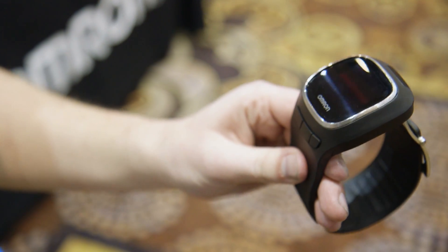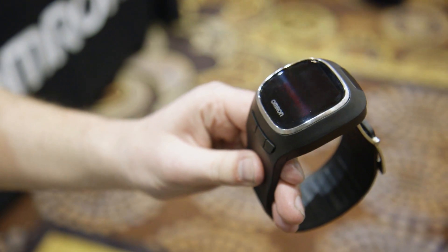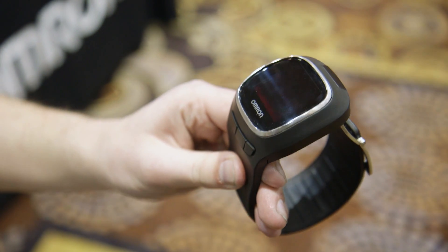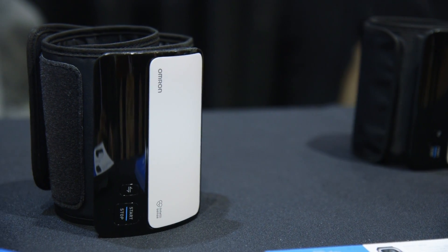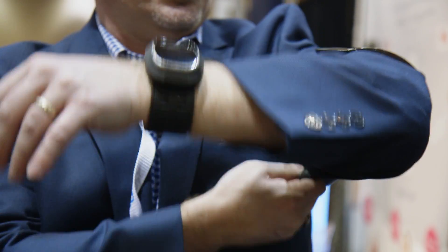Omron's intent is to make it easier for people to monitor their blood pressure on a daily basis and to integrate that activity into their lives. In addition to this wrist monitor, there's also an upper arm monitor that performs the same function.